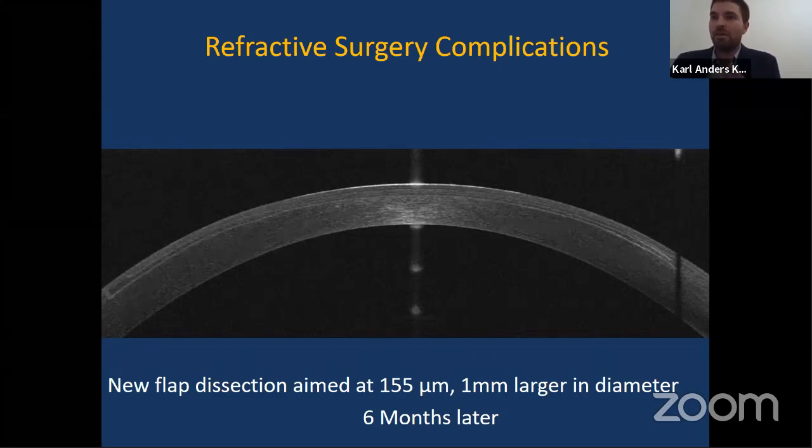deal with some patients. Now, before Alio was talking about OSSN, we clearly use this type of technology, even in these cases. I'm thinking about a patient that we saw last year, a 16-year-old patient with an HPV-associated OSSN, conjunctival dysplasia, which was invading the limbus, and the OCT imaging was fundamental in finding the correct plane also during surgical maneuvers. So I have to say that we also use this type of technology for the same type of pathology.